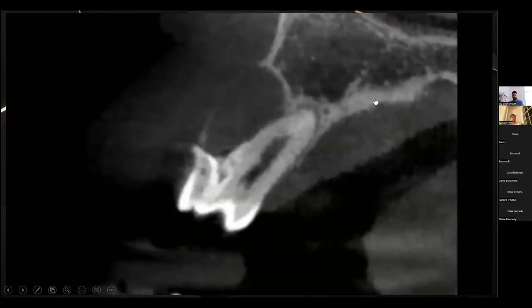She's very young. If you're doing any sort of vertical compaction trying to get a resin, it's very, very easy to extrude in these cases, and this is where the putty does really come in handy. Again, I thought I had a video for this case, but I couldn't find it for the life of me. But we obturated with the Bioceramic Putty, even into the perforation over here.